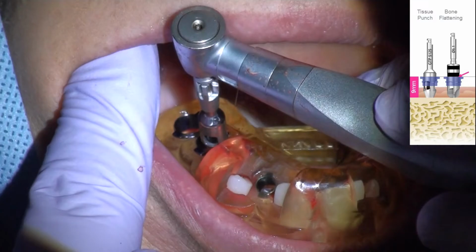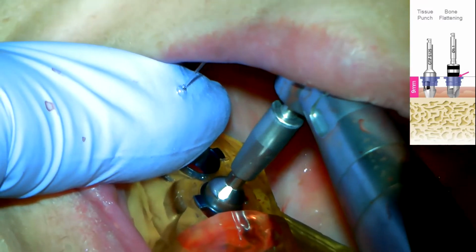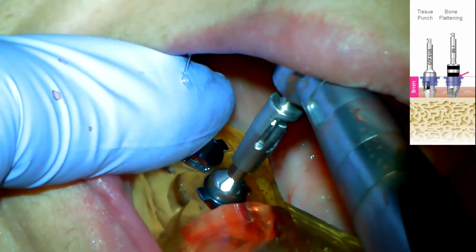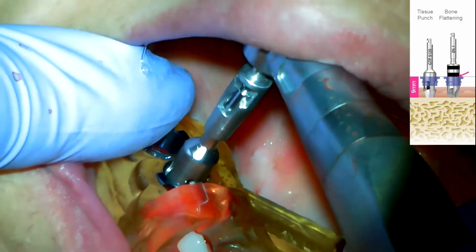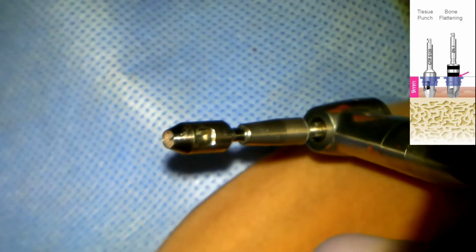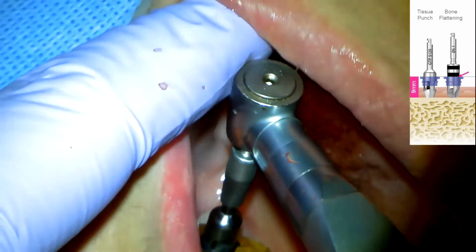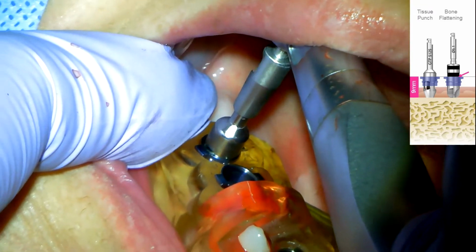Real big for me. I'm going to push down. I like a little wiggle. Push hard. That typically does it. There's the tissue. I'm going to see if the assistant can suck that out with the suction. Beautiful. We're going to go and do the back one now.